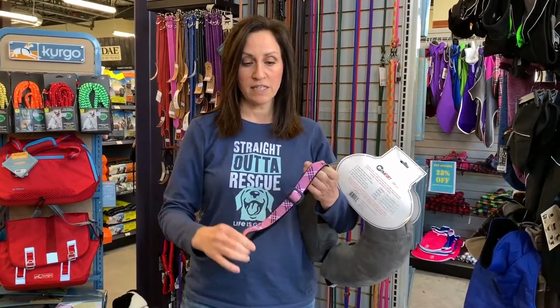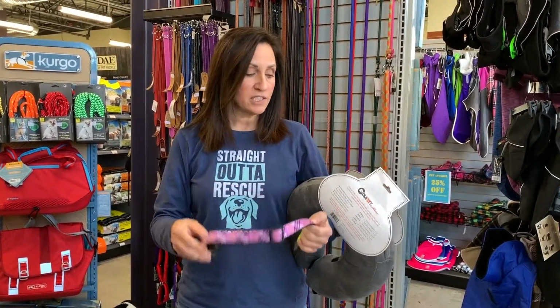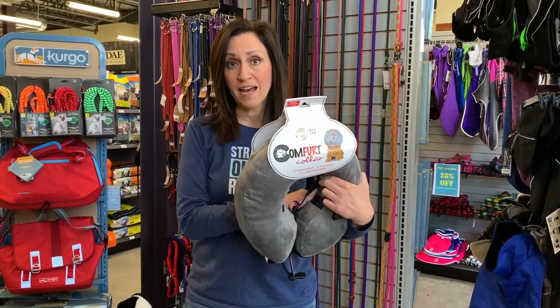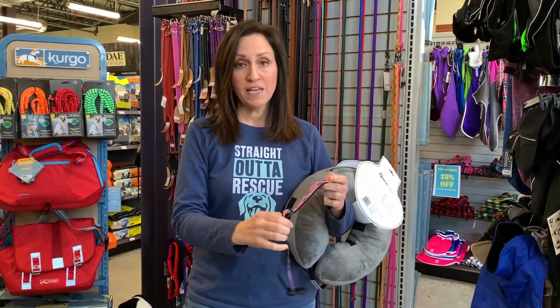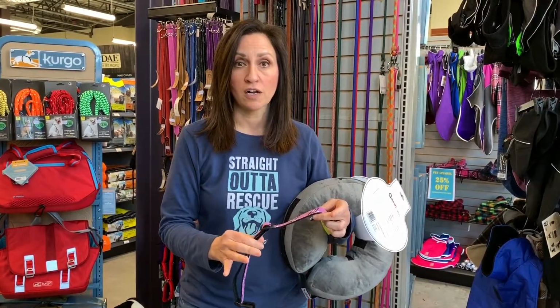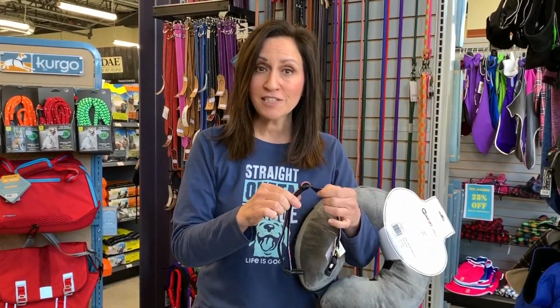So this thing, let's say, might be fitted for your dog when you're walking them outside. If I thread this through the inside of the inflatable collar or the padded collar like this, the problem is that it's so tight, it's like choking them. So you need to make this collar that you use with one of these much longer. Now, if you then take your dog outside with this same thing, now it's loose.